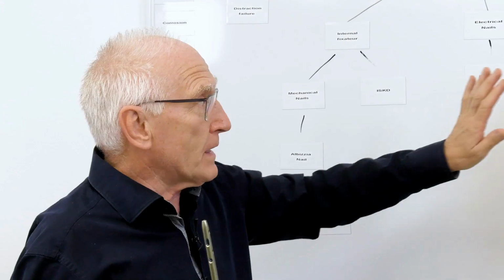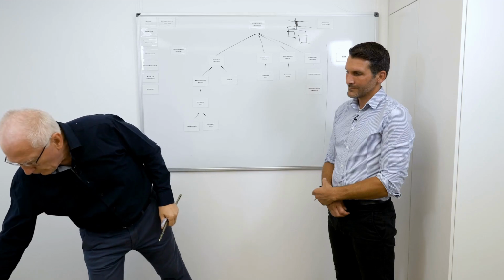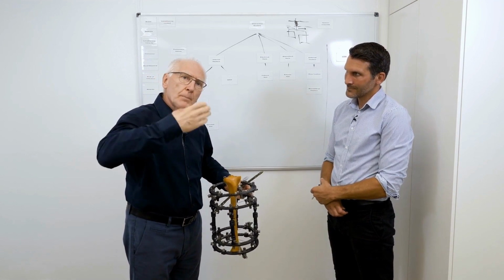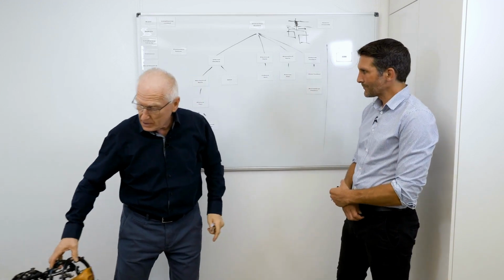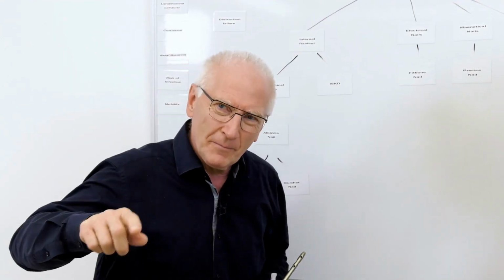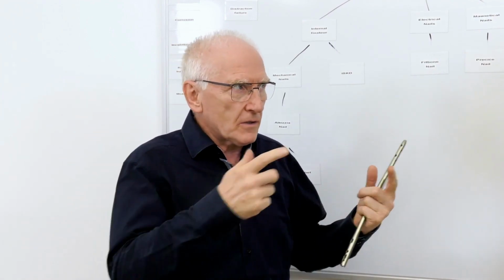If I have external fixators, then I can attach whatever I want in principle. With the monolateral fixators, I can attach unilateral, huge telescopes that attempt to move the bone apart. I can't do that here with the electronic systems. So miniaturization plays an enormous role there. And through miniaturization, in conjunction with stabilization, you'll surely talk about that later.